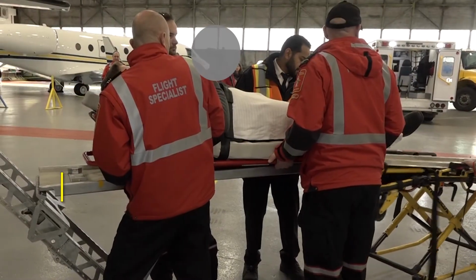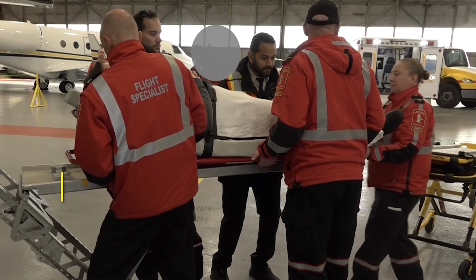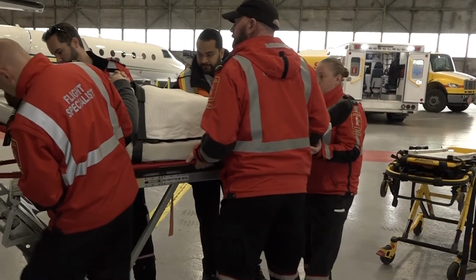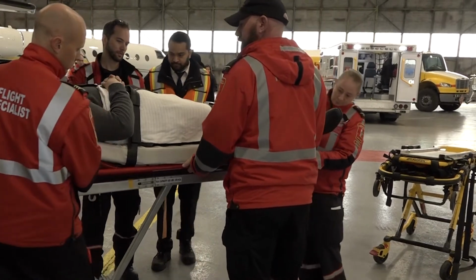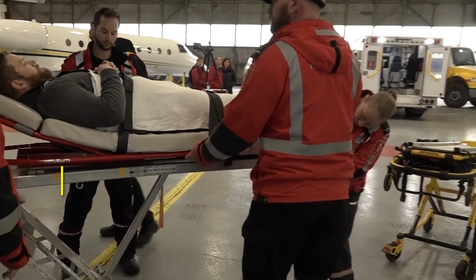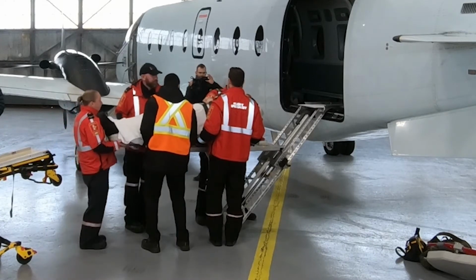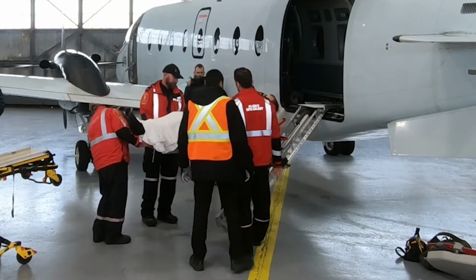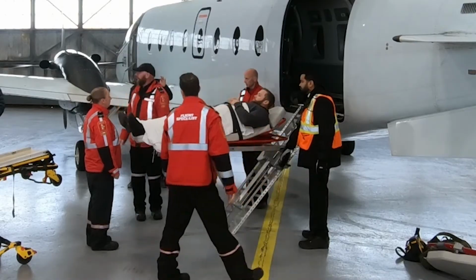9. As directed by the in-charge person, the 4 people continue to laterally move the aerosled onto the platform until the 2 individuals nearest the aircraft say stop, indicating that the top red metal frame under the aerosled has reached the marked areas on the platform, currently marked with yellow tape. At this point, the person at the end of the stretcher will move the stretcher away from the end of the platform and will position themselves at the end of the aerosled to assist with lifting the end up approximately 2 inches over and into the locking system on the lift platform.